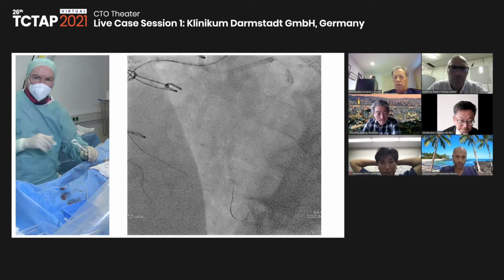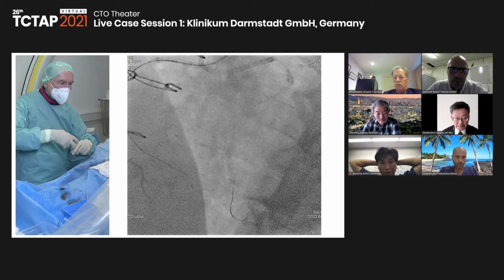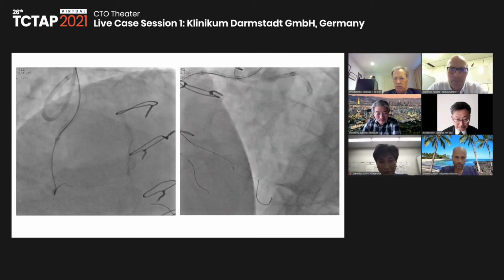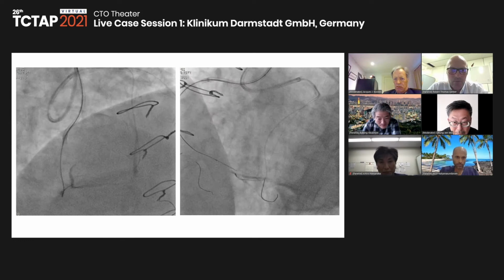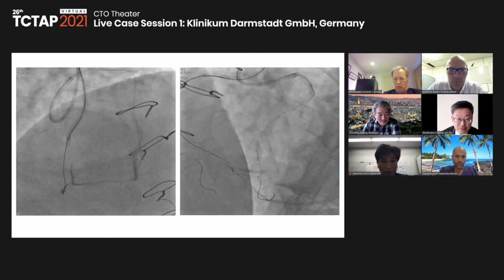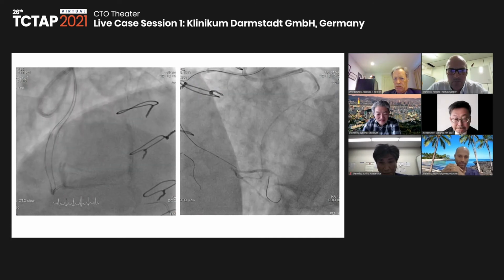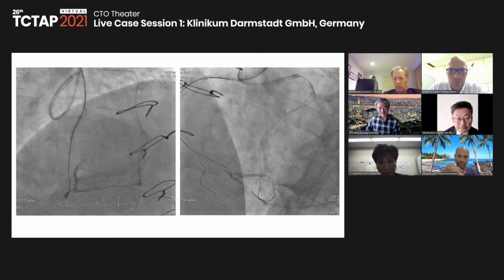Yeah, both planes. So I could aspirate blood here. So I inject. Yeah, we've got a landing zone upstream too. That's great, into the distal RCA. So actually the branch, my wire already went right. Yep. The XT should be good here, I think.